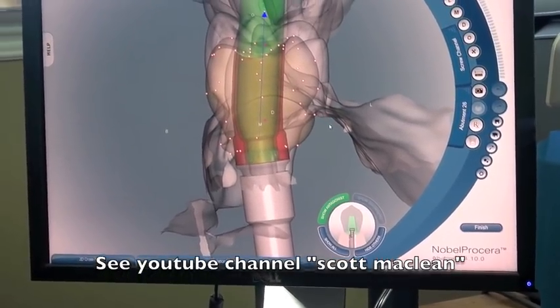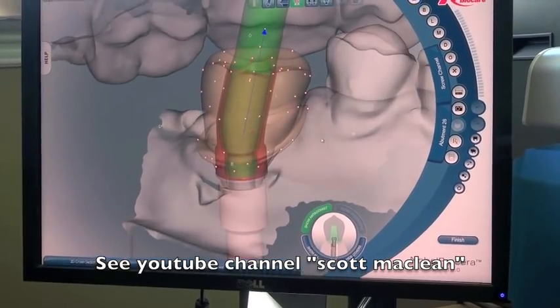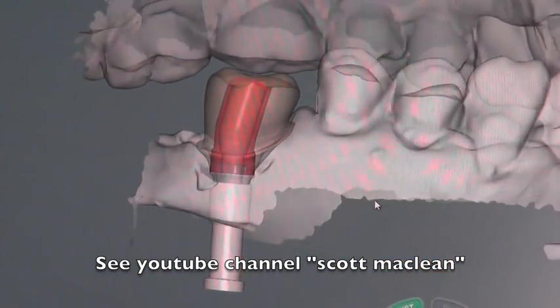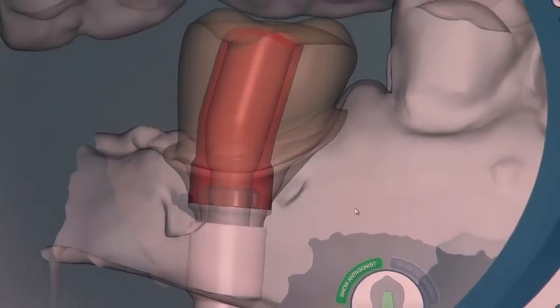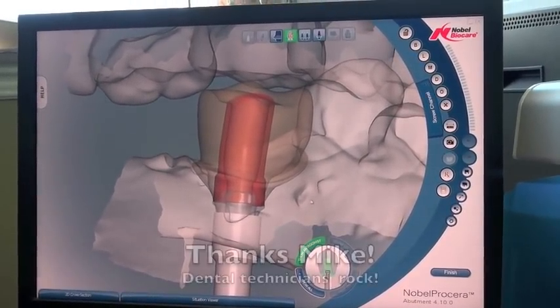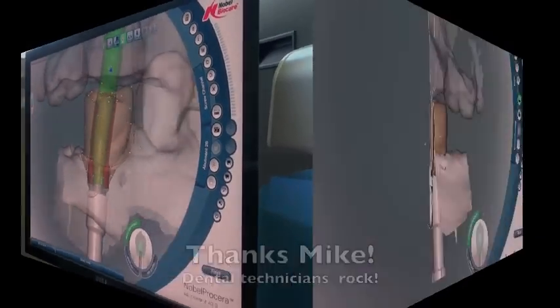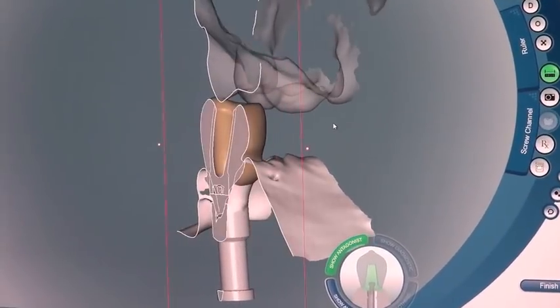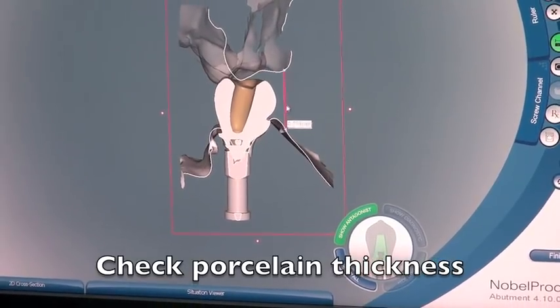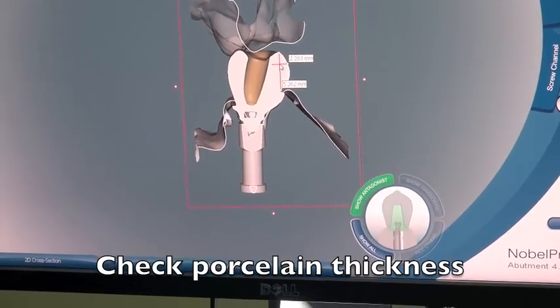So below the gingiva it's going to follow exactly the way that we want it to follow, and then above the gingiva we're going to take the screw channel and turn it. You can see here the turning action of the screw channel shown in red, which shows the minimum thickness that we have to have. Mike had to do some manipulation of the software, which is quite easy to do — you can take it and turn the channel, and our goal is to create an ideal channel for the functional cusp on the opposing arch.